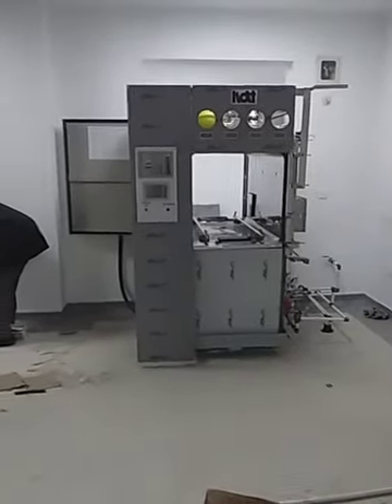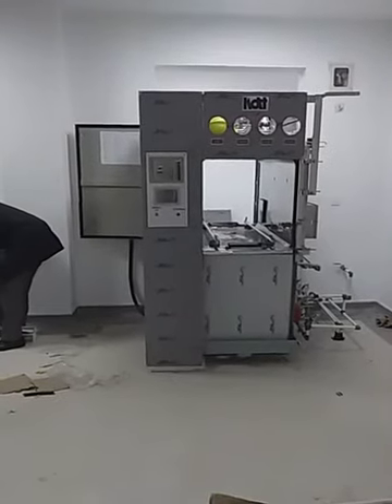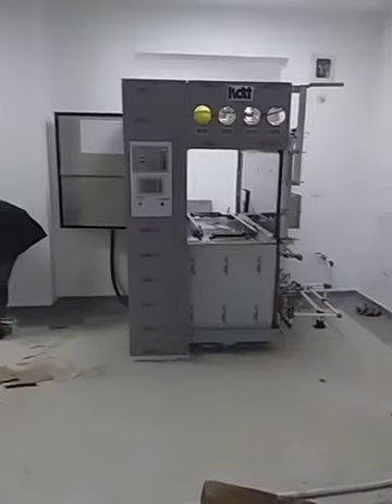This is an autoclave machine and the installation is on. You can see half the machine is installed and half the machine is still remaining. Slowly we are going further.